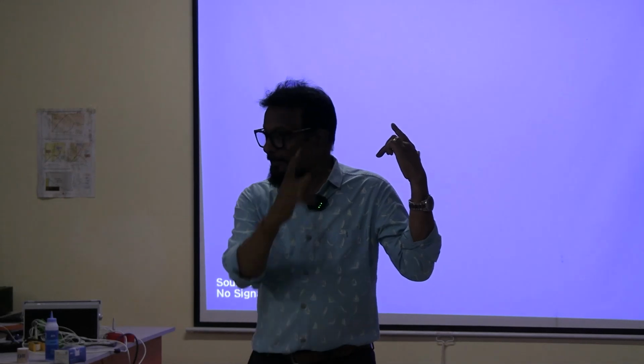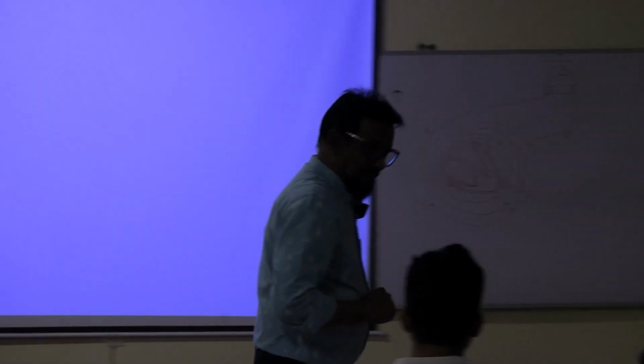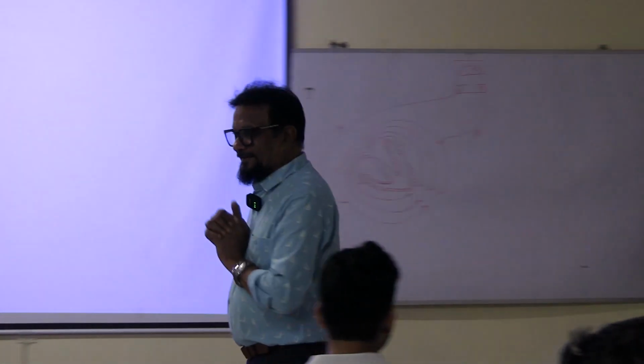In lead 3, we will be connecting left leg, left arm. Very simple. So this is bipolar lead. We also call it standard limb lead.